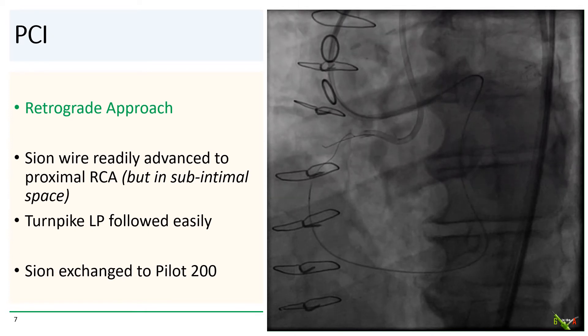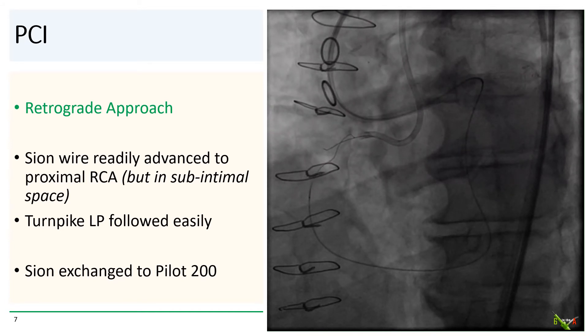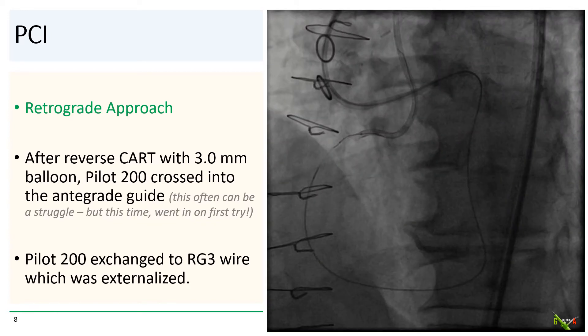After that, we were able to get the Turnpike LP fairly easily up into the mid-RCA and used it to switch out the Sion wire to a Pilot 200. We did a reverse CART in the proximal RCA with a 3.0 millimeter balloon, and after just a single inflation, we were able to get the retrograde Pilot 200 wire to cross into the antegrade guide. This often can be a struggle, but this time it went on the very first try. The Turnpike LP then followed into the antegrade guide where we trapped it with an antegrade balloon in the guide and exchanged the Pilot 200 to an RG3 wire for externalization.